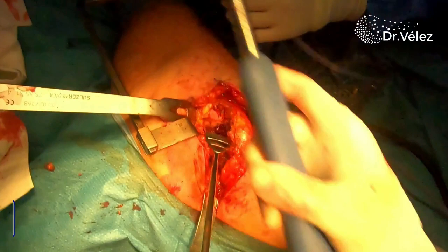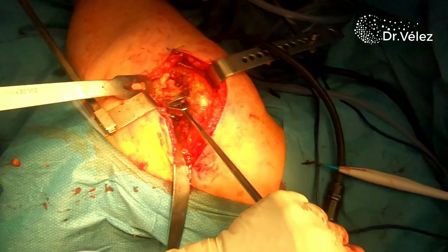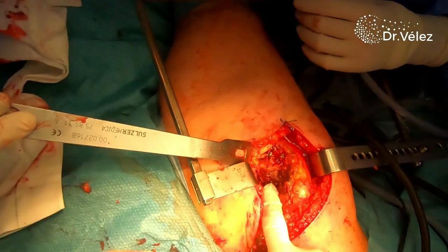Once we have the femoral neck prepared and the metastatic tissue has been removed, we then proceed with the reaming and broaching of the femoral canal according to the specifications of the hip prosthesis that you're using.